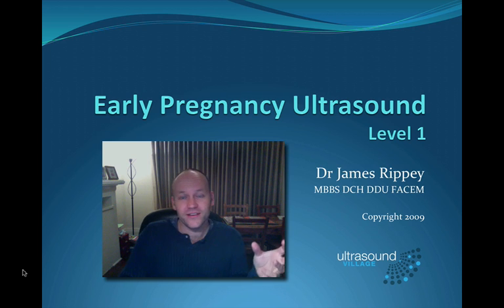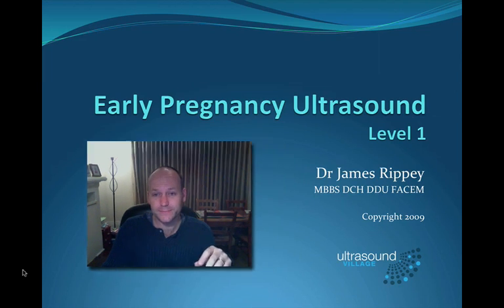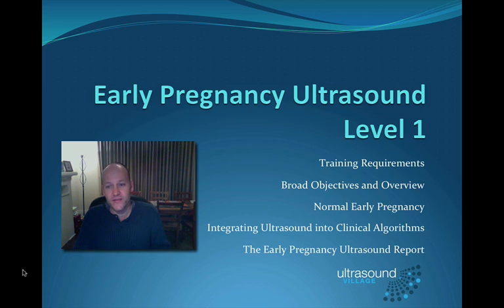Having said that, I think early pregnancy ultrasound can really affect the way you manage patients, even if you only know a little bit about it, as long as you know and practice safely. In this lecture, I'm going to cover the training requirements that are needed to be skilled and appropriately knowledgeable in early pregnancy ultrasound. We're going to go through the broad objectives of early pregnancy ultrasound level 1. We're going to go through normal pregnancy and the changes that you see both in reality and on ultrasound. Then we're going to touch on integrating ultrasound into your clinical algorithms.